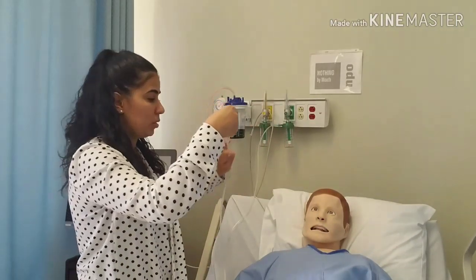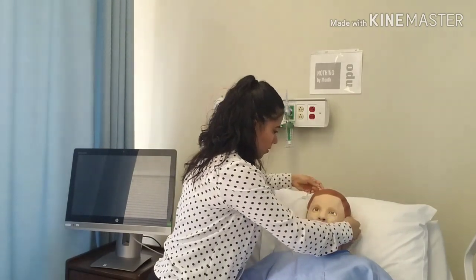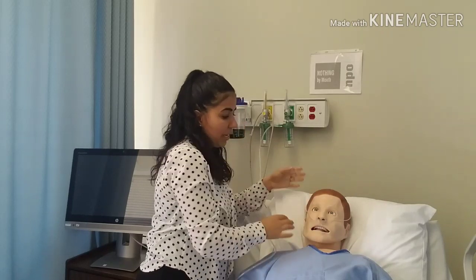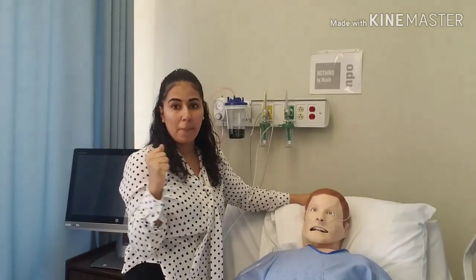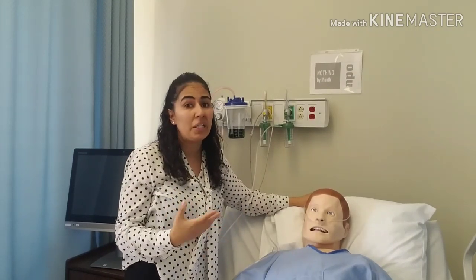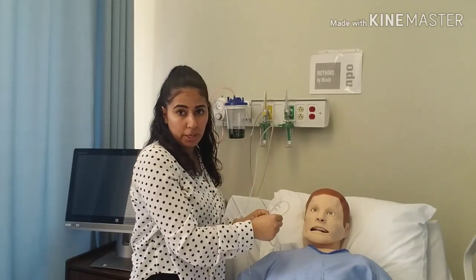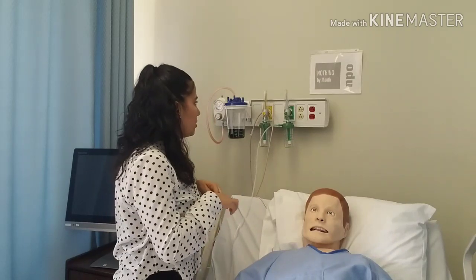I have seen people put the nasal cannula on the patient backwards — this is inappropriate. If the patient gets out of bed with it on that way, it's going to jerk them back. The whole purpose of the nasal cannula is that they're a little more independent with it, so it's very important that you put it on correctly.